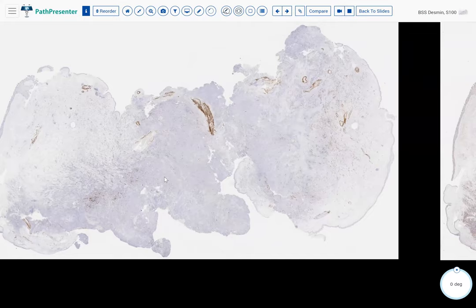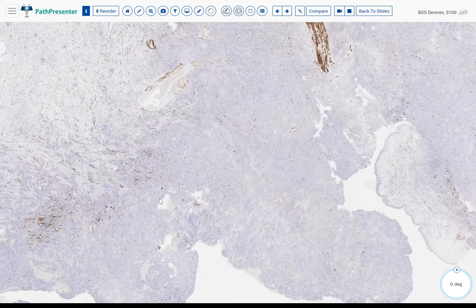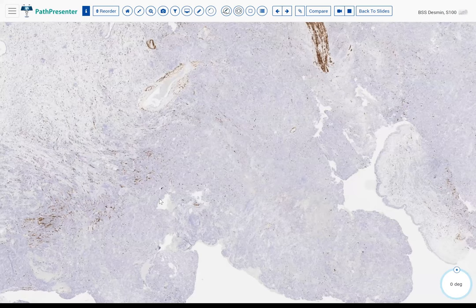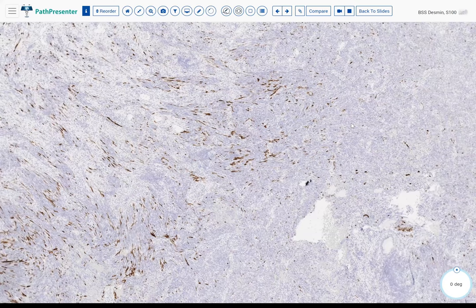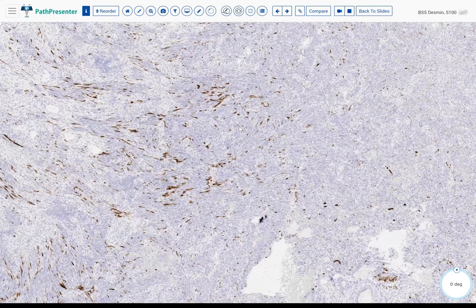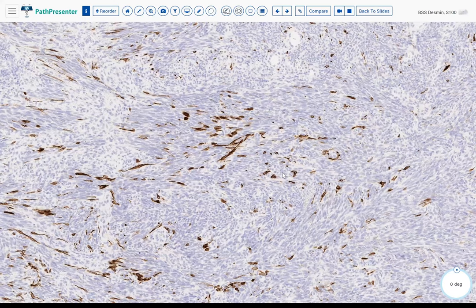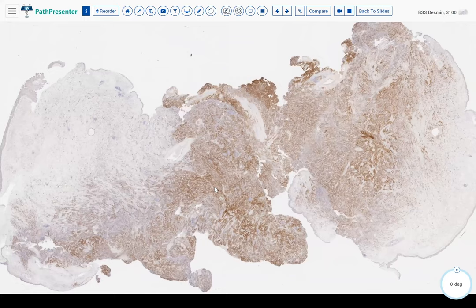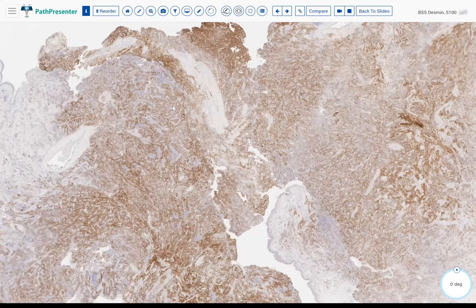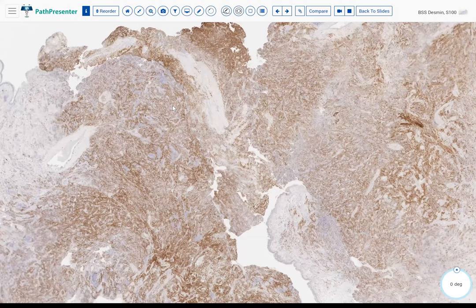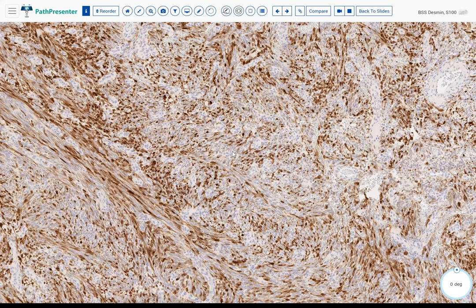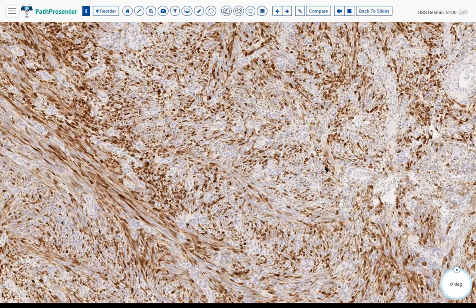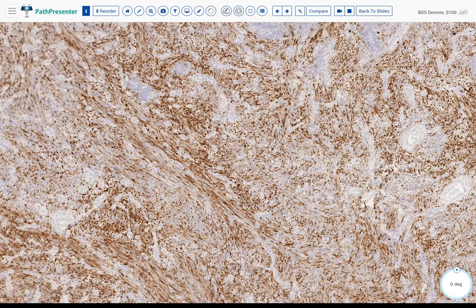The stain here is desmin. This tumor was negative for keratin and has some multifocal positivity for desmin — there are cells that are clearly positive. This stain here is S100, which is quite diffusely positive in a convincing way. You have to be careful with S100 sometimes, as it can stain intertumoral dendritic cells, but here it's clearly staining the tumor cells with convincing cytoplasmic and nuclear positivity in a multifocal to diffuse manner.